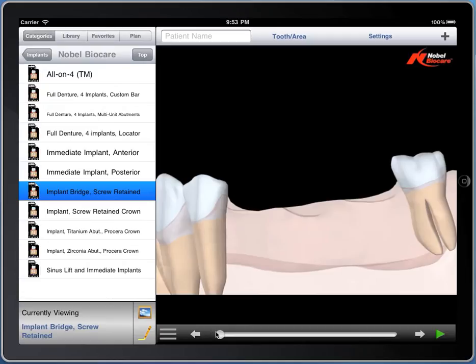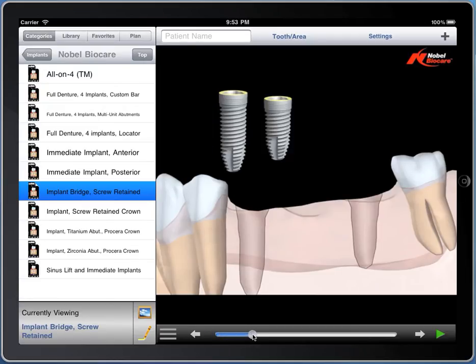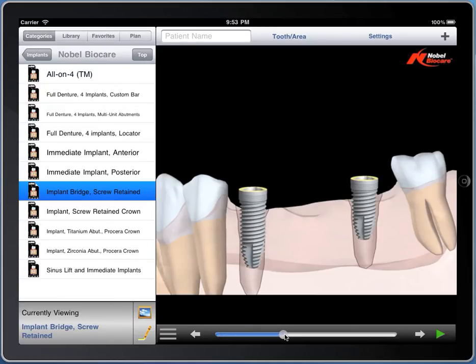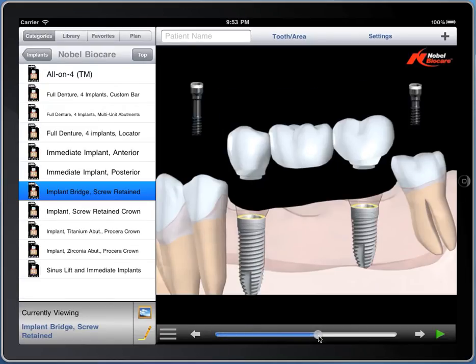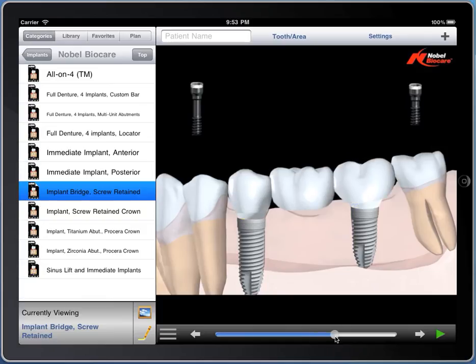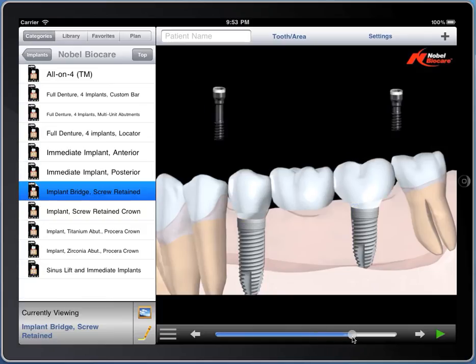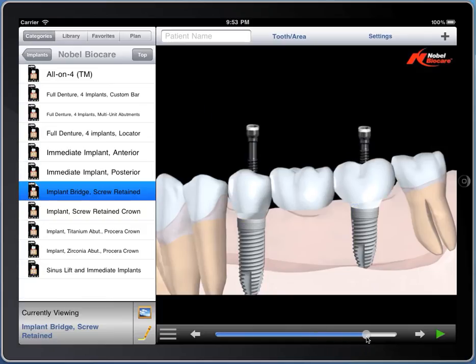Here we have a bridge being shown — implants are placed, one is a shorty, and then here is a custom Procera-style bridge, which is screw retained.